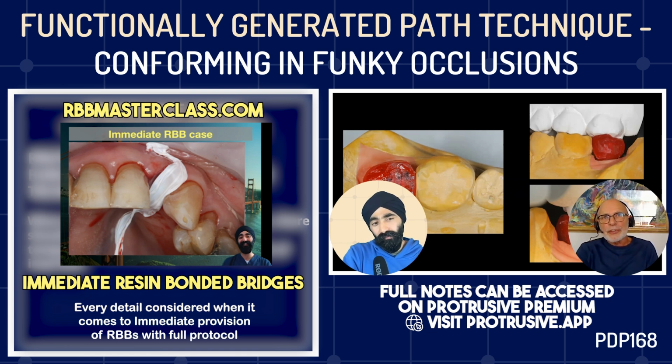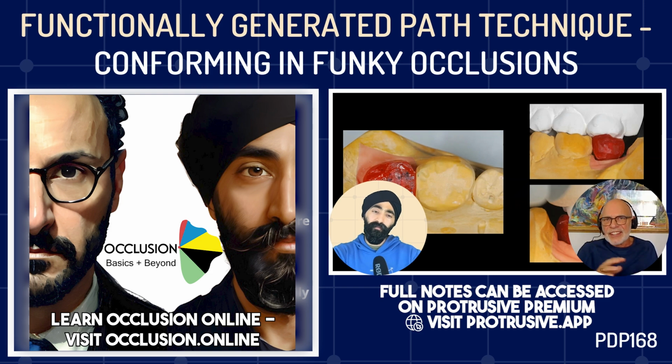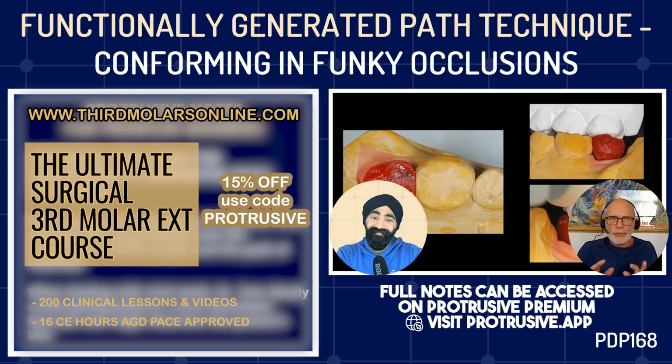No. Basically, no. Obviously, if you're doing implants, it's not pertinent at all. It is pertinent if you're using it on vital teeth. But I try really hard in these cases not to give the patient a local anesthetic, because if you give the patient a local anesthetic and then say tap up and down and slide around, they're a bit disorientated. And I've never had a patient suddenly go, oh, it's getting all hot, without a local anesthetic. So I don't think that's an issue. Certainly not with the GC pattern resin that I use.